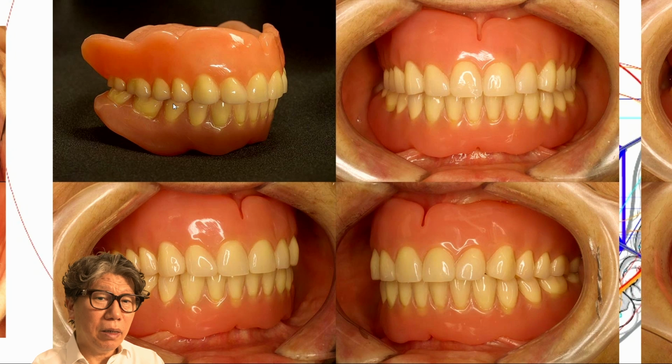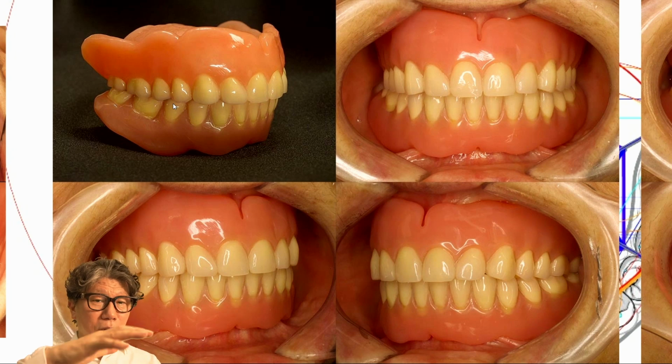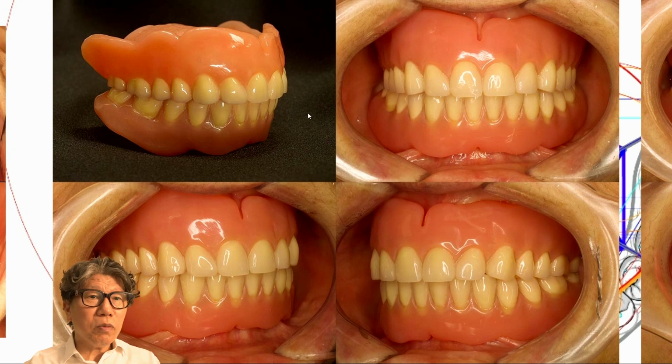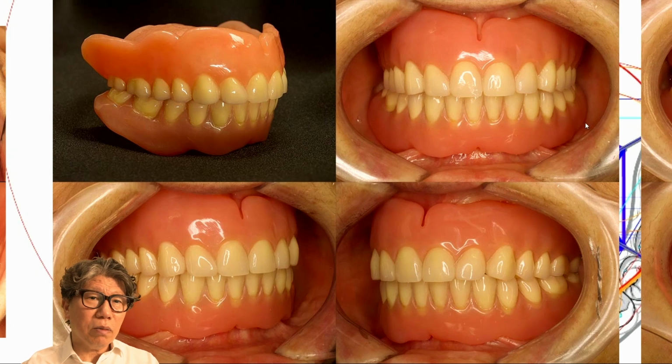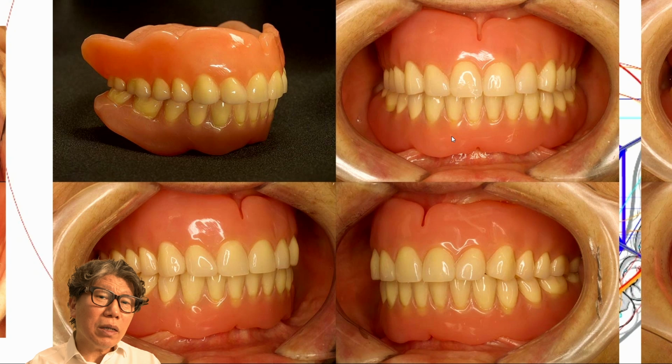I've seen quite a lot. If these dentures slide against each other during occlusion, he comes back to the hospital because his gums continue to hurt. So if it's painful here, you trim here. If it's painful there, you trim there. And if you keep trimming, all the denture borders disappear. Such cases are very common.